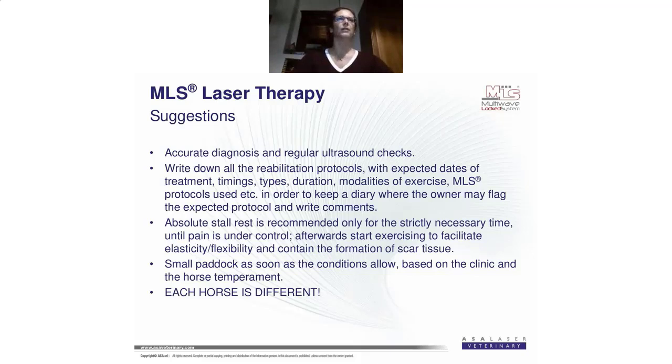So you will write down the frequency and the energy and how many points you used, in order to keep a diary where the owner may flag the expected protocol and write comments.